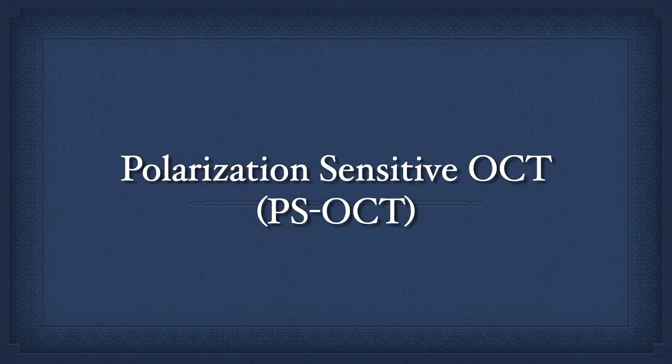And so first I want to go to polarization sensitive OCT. So this is something we've looked at since the 90s. We've actually used it. It's a powerful tool. What it does is you're sending in polarized, I'm going to give you an analogy. You're sending in polarized light, and normal tissue isn't organized, so it's going to back reflect independent of the polarization state of the incident light.